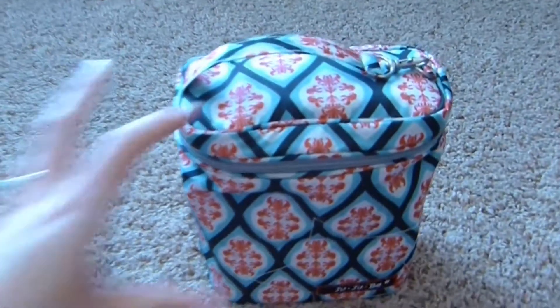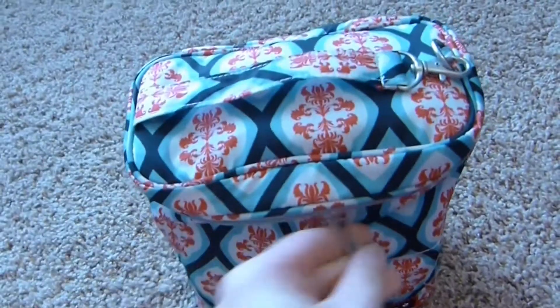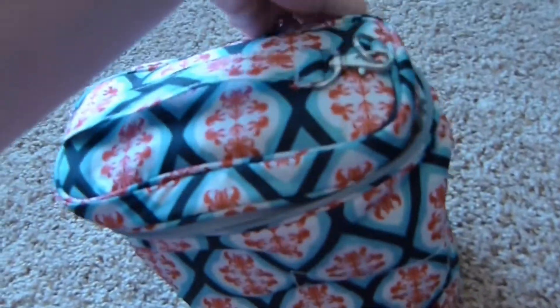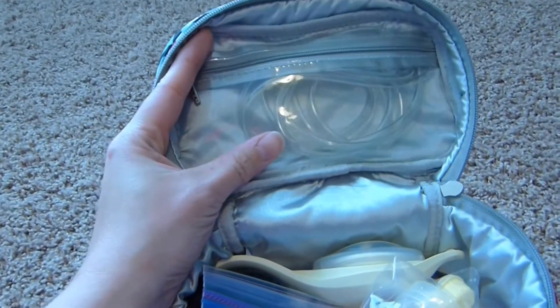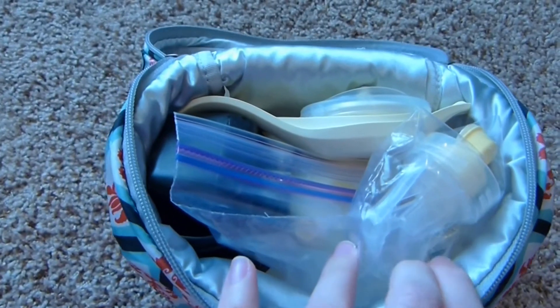So this is my fuel cell — it is in the dreamy diamonds print. Open it up here, and in the top little zipper part I just keep the tubing.